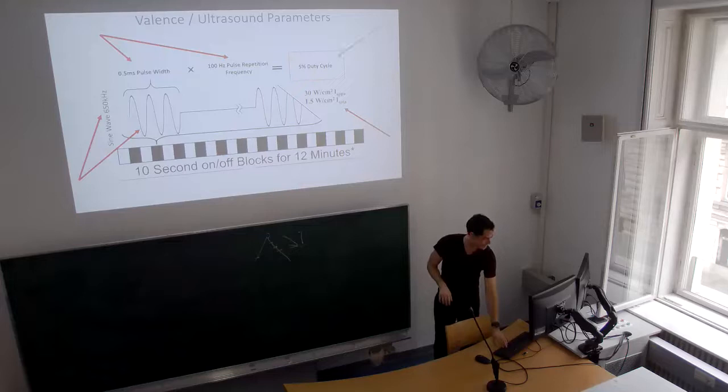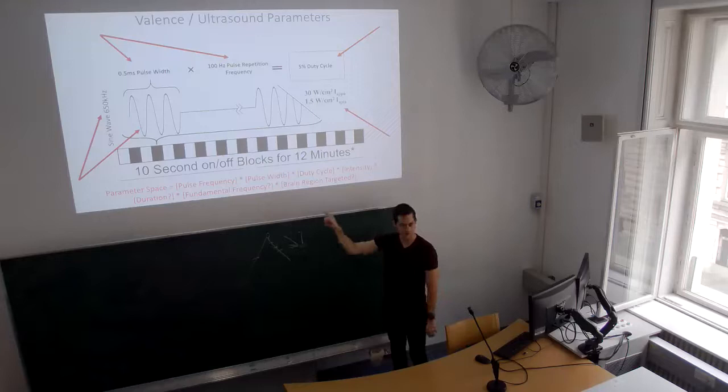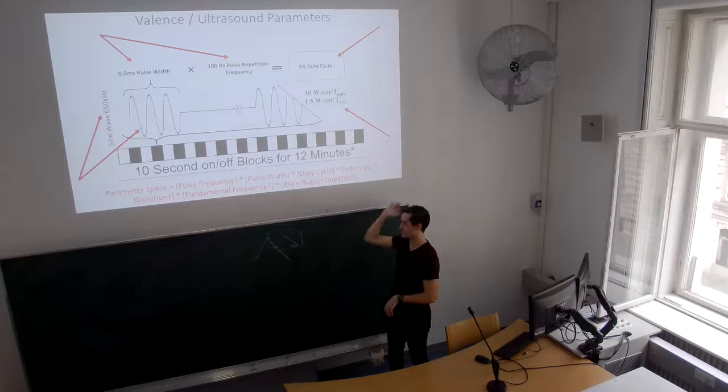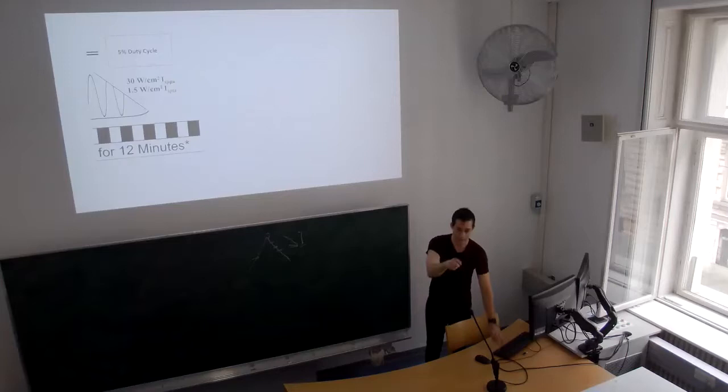Okay, hold that in your mind, right? Hold the duty cycle thing in your mind, but also note how high dimensional this parameter space is. So there's a lot we don't know. People might say, why don't you just map the whole parameter space in animals? And it's because it's like a million conditions, because it's all these things and some other things I haven't mentioned, like how long do you stimulate for? What brain region are you targeting? It might be cell type specific.